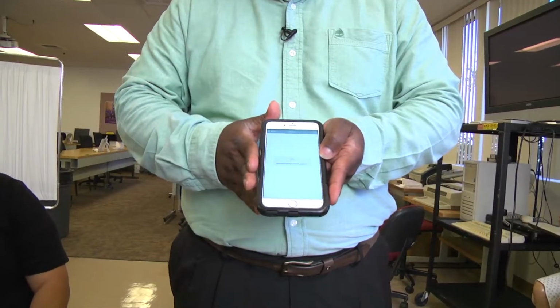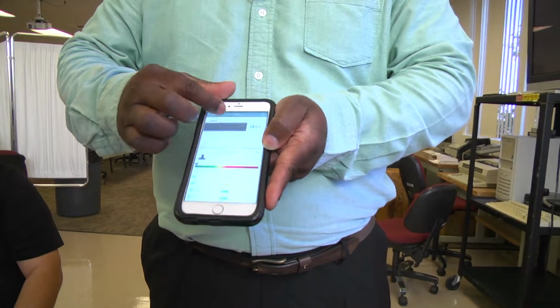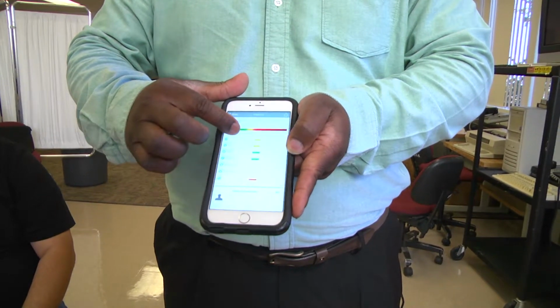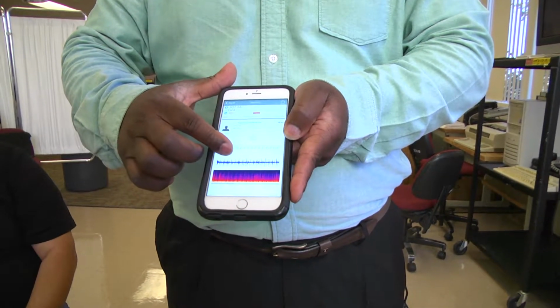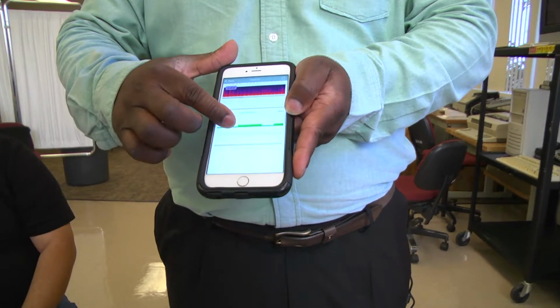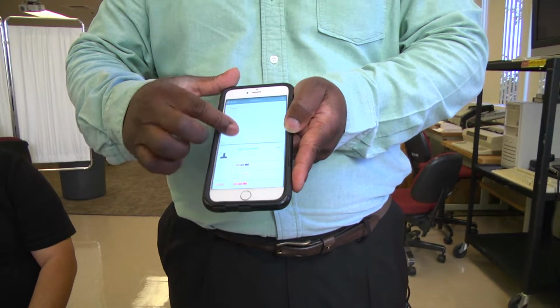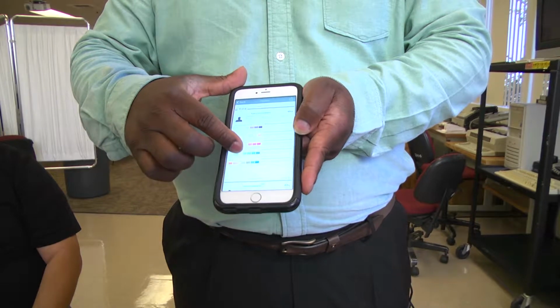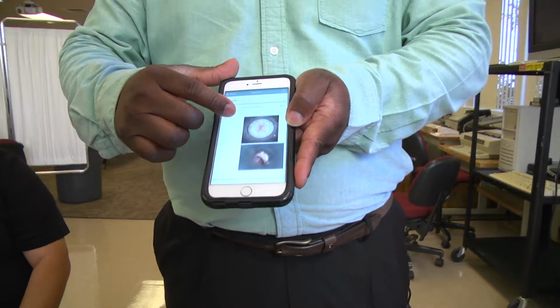We're downloading a PDF. It has a cover page. It has the first thing we did, which is the vitals. Then we did the auscultation. Then we did the ECG by itself. Then we manually entered the blood glucose. We entered the urinalysis. Then we did the visual exams.